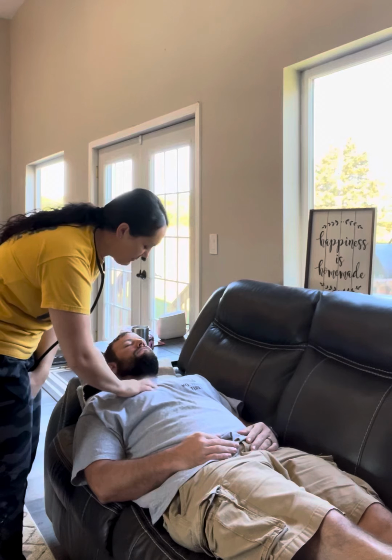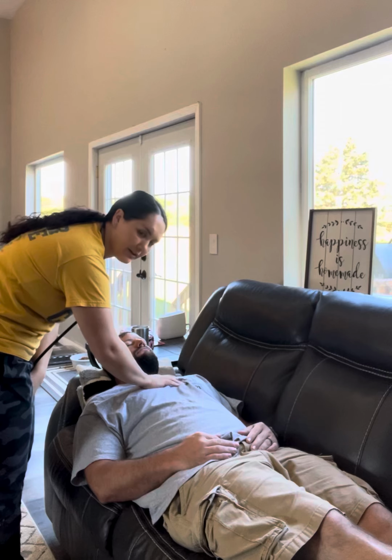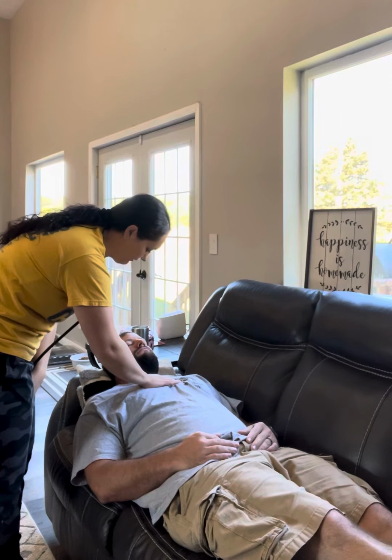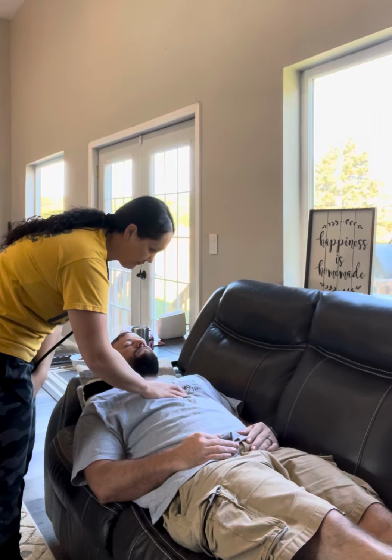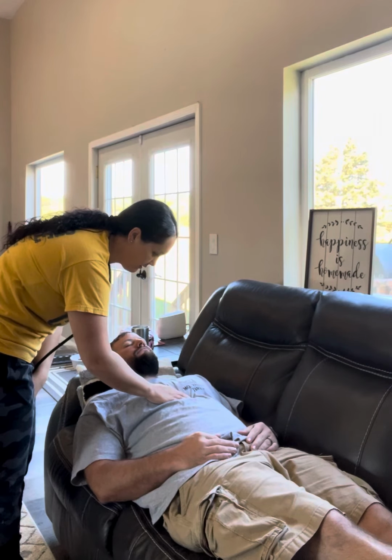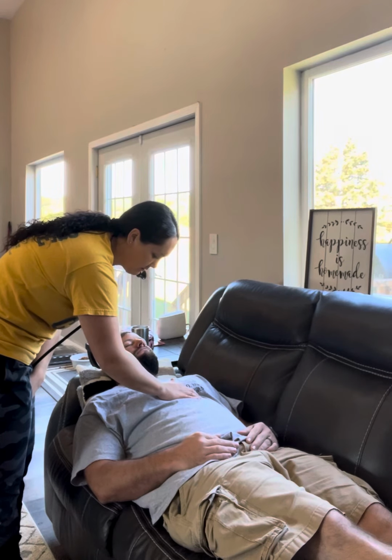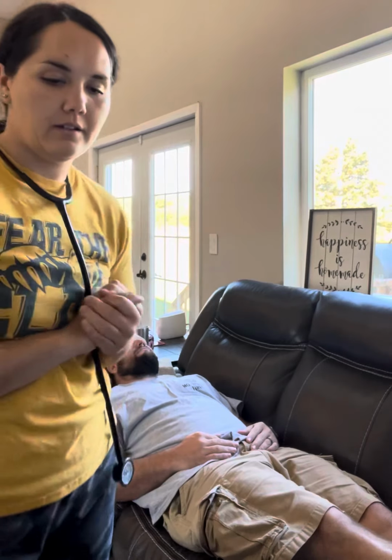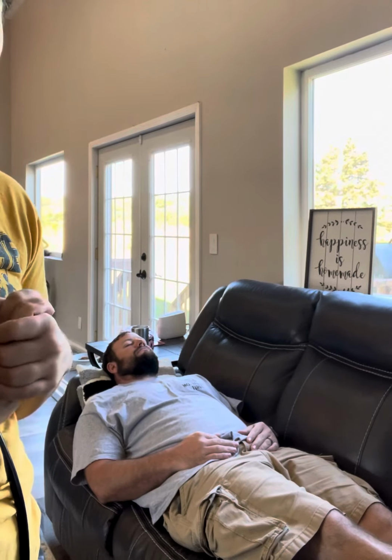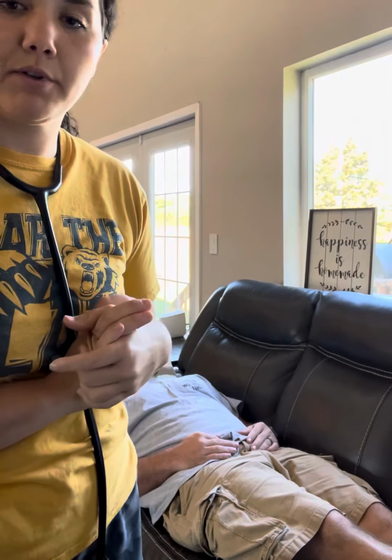The second intercostal space on the right. Second intercostal space on the left. Going down the third, the fourth, the fifth. And then checking for maximal impulse, the apex of the heart. I don't note any heaves or lifts, so I'm going to go ahead and auscultate in those 4 areas, checking for any murmurs or extra heart tones.